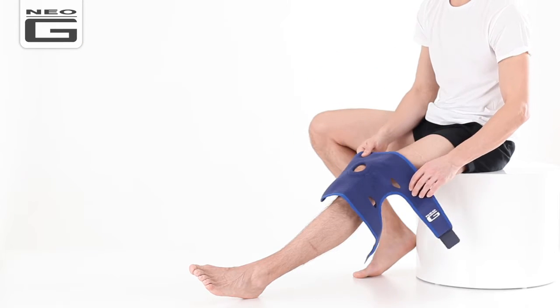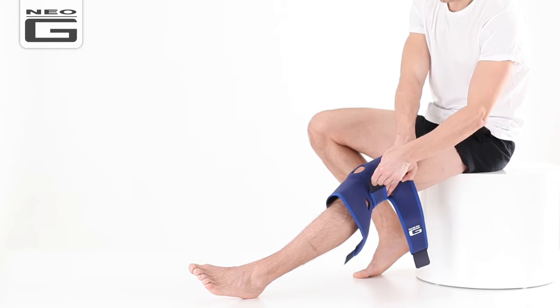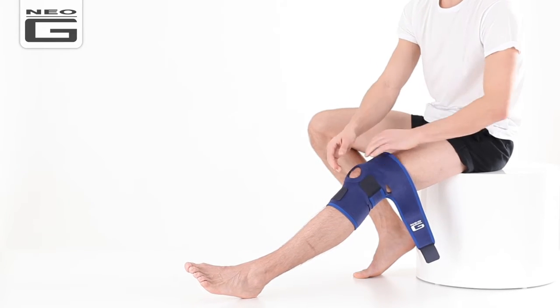Position your kneecap in the centre of the support. Wrap the middle strap behind your knee and securely fasten. Finally, fasten the bottom and top straps and adjust until firm but comfortable.